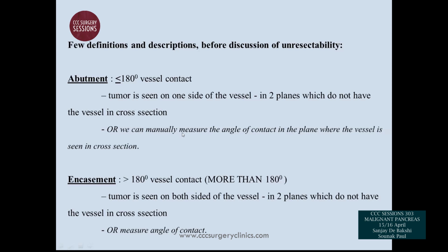As such, we'll have to confirm it on two planes in which the vessel is not seen in cross section, to confirm whether we are categorically saying abutment or encasement.